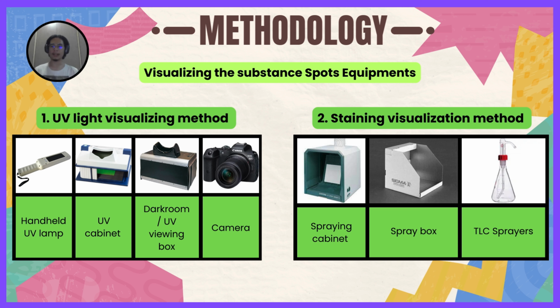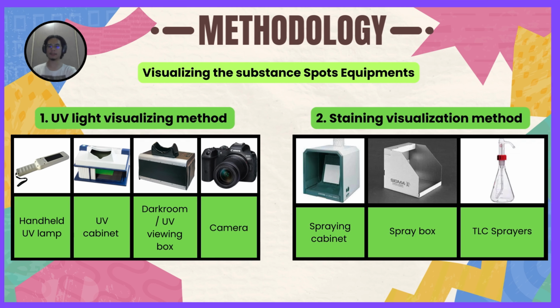To end it, the whole reason this type of method even exists is because some drugs are colorless and invisible to the naked eye, making it essential to use appropriate equipment and techniques to visualize substance spots.